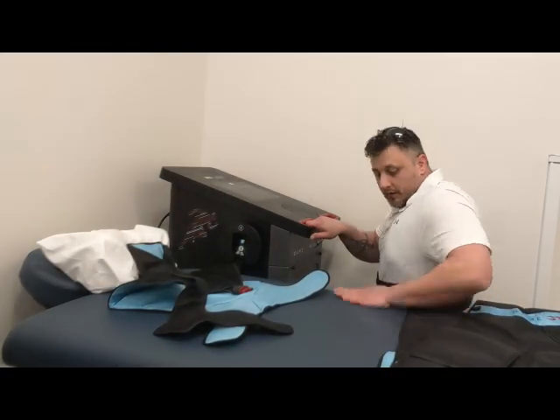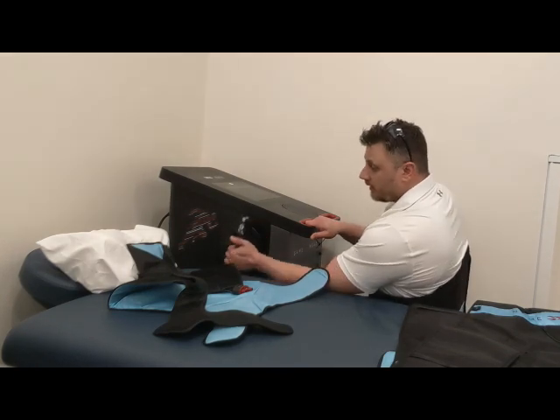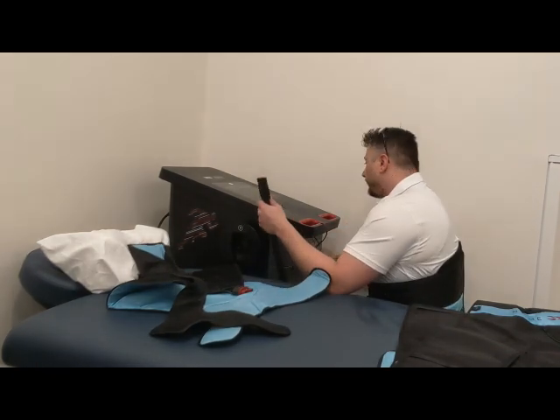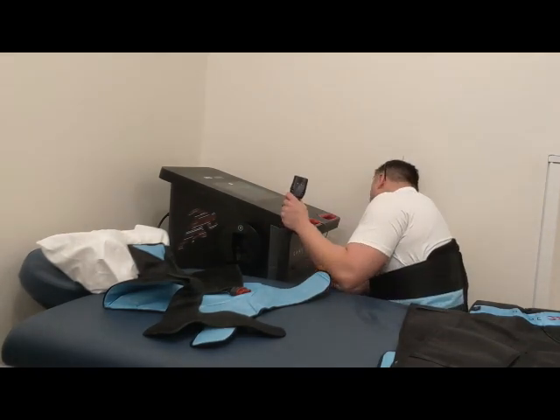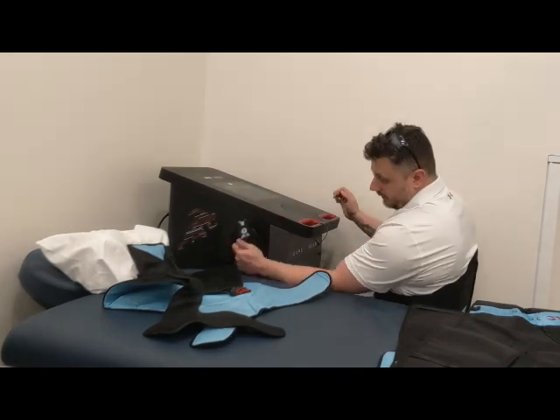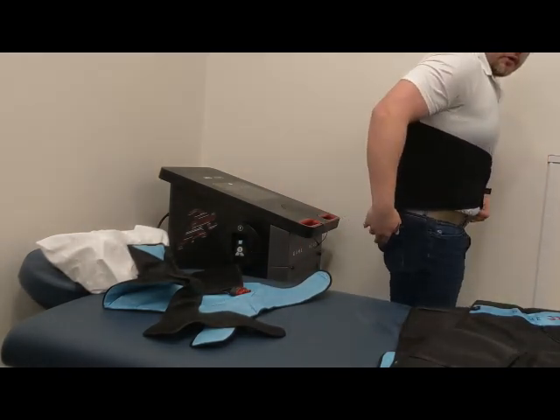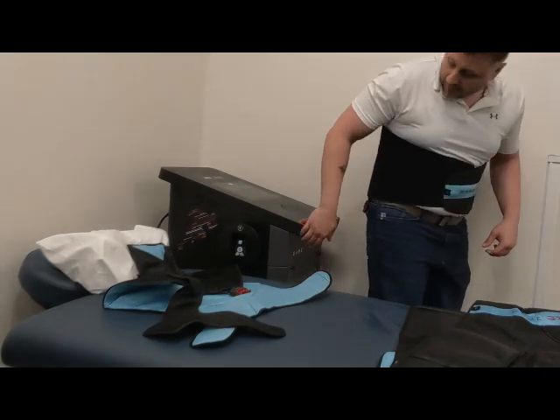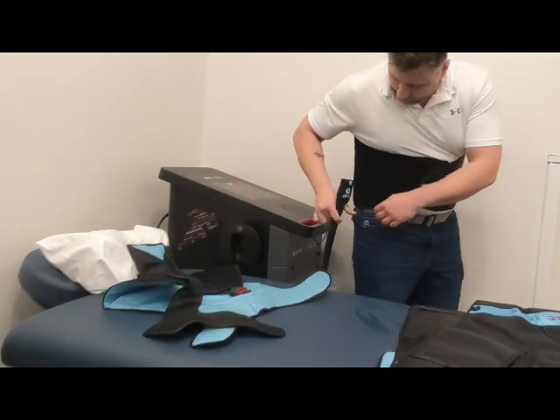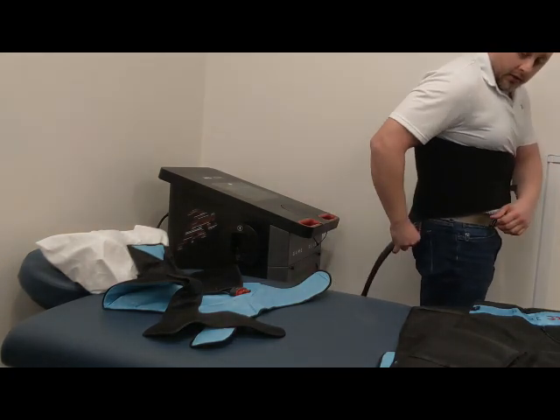Take a knee here. I'm going to show you the connection process. There is one connector on each side — we've got one and two, left hand is one. The dongle is now facing down. I'm going to grab one and connect it to the dongle.